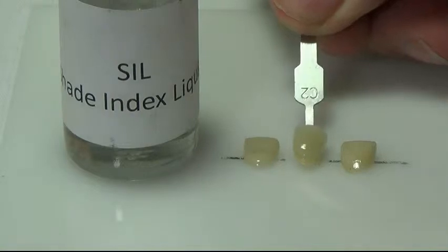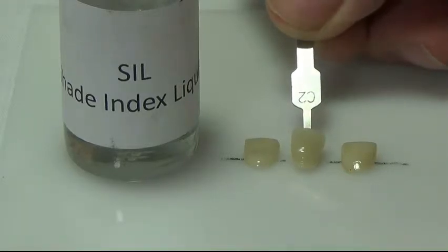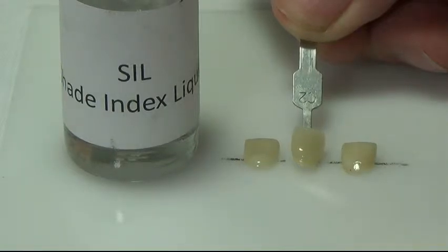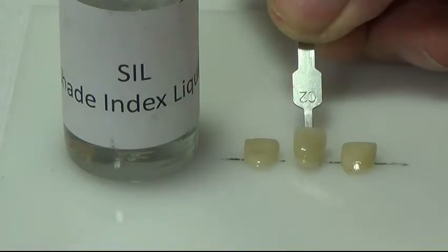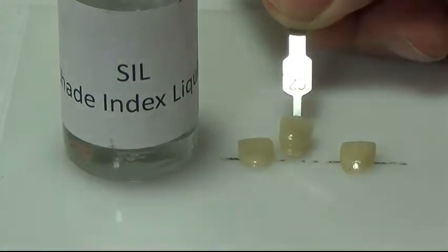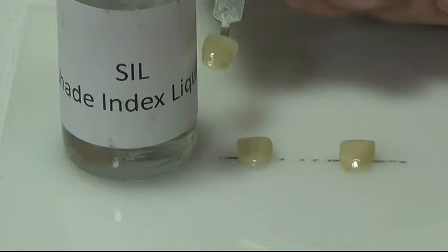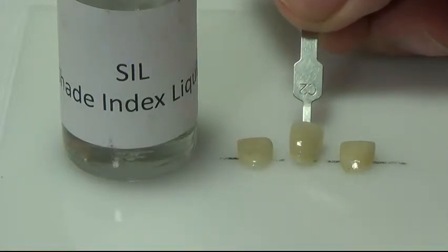Before we do the actual shading demonstration, I would like to show you something about your refraction index shading illumination system that you received. The crown on the left has your polychromatic shading stain. The crown on the right has ordinary common stain, which is a masking reflection system. You have two things working for you: refraction illumination of the polychromatic shading crystals, and your SIL or shade index liquid, which enables you to see what your unit will look like before it's fired.